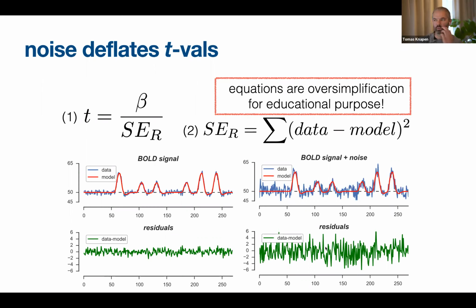So whether you find something in fMRI depends on these residuals, our arch enemy. If you manage to explain the signal better, it will decrease your residuals and give you the opportunity to find something where you could not before. What that means is that if you find some structure in the residuals that you manage to explain, you're golden. That's what you want to be doing.